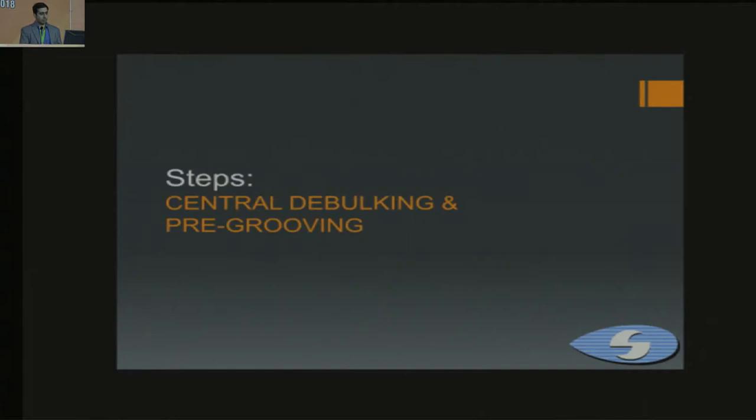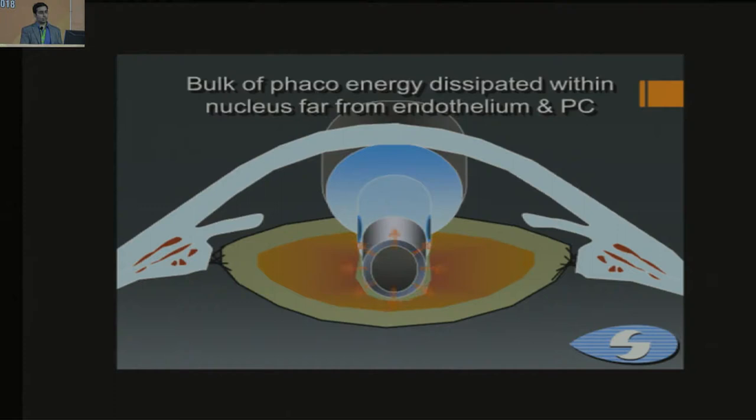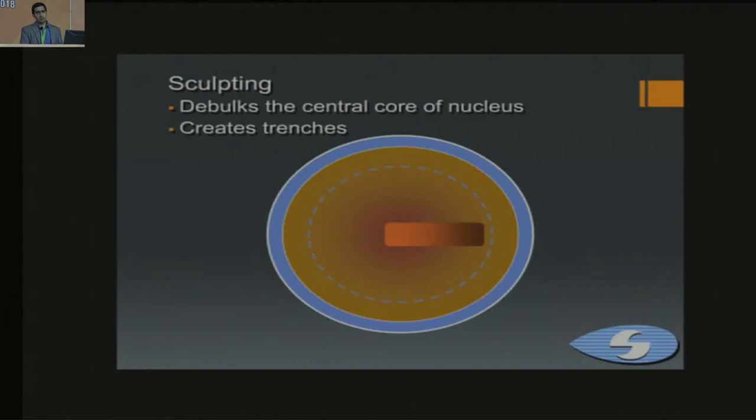The first step is making a trench properly, which is central debulking and grooving. We use the phaco probe so that the bulk of the energy is dissipated into the nucleus, far from the endothelium and far from the posterior capsule. When making a trench, start proximally, make the trench towards the center, rotate to the other side, and make another trench — eventually creating four grooves that you can easily crack later.